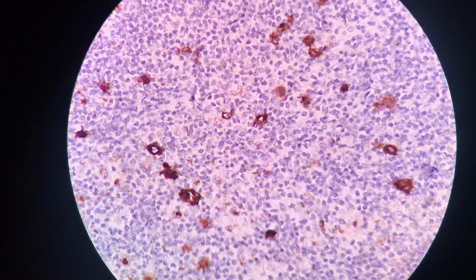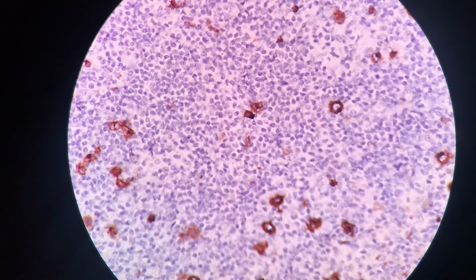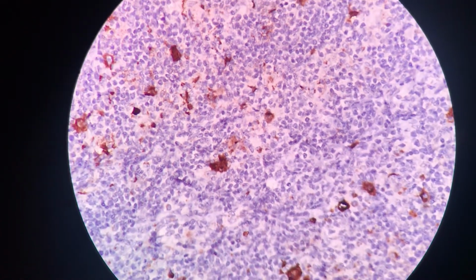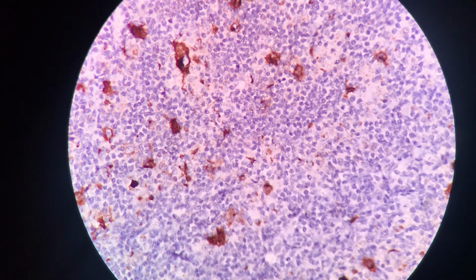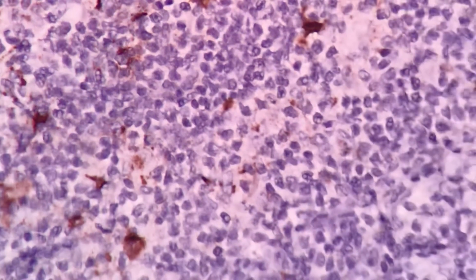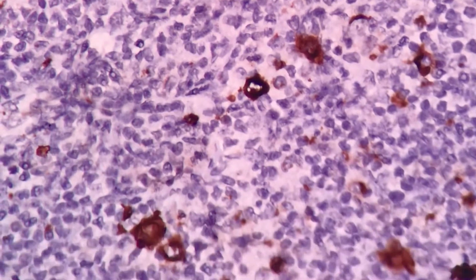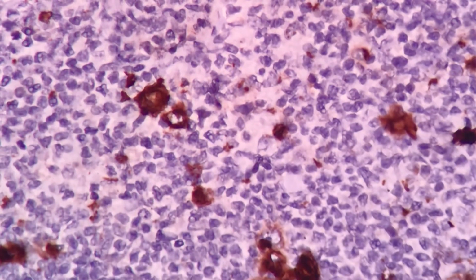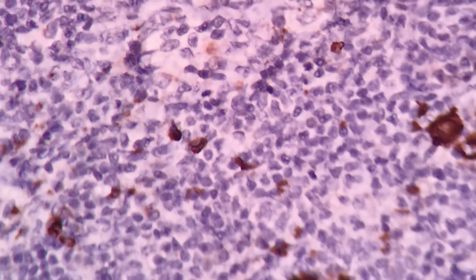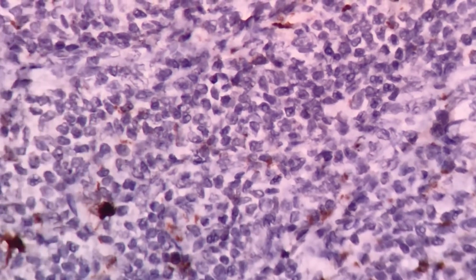If you see, there are macrophages which have faintly taken up the staining. For example, in this area, if you see, some of the cells are taking a hue of brown. That is because of the imbibement of the antigen due to constant host versus tumor interaction, and that should not be interpreted as a background staining.